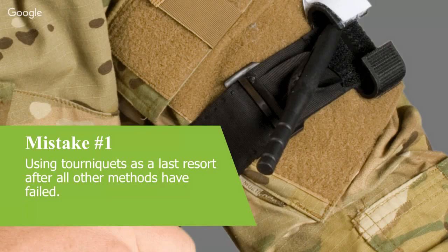In a civilian environment where you might have a bit more of an opportunity to assess a wound, to expose it, you've got better light, you've got stable tactical conditions, then it may be more appropriate to assess it quickly, try something else first. But the point is, move it really quickly onto arterial tourniquet application if you're failing with your other measures.